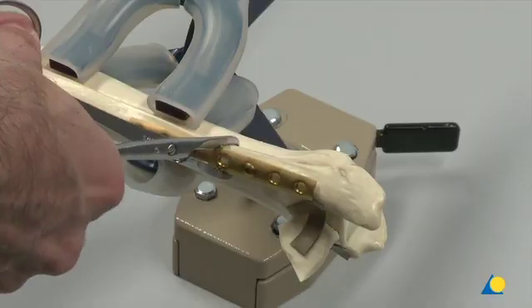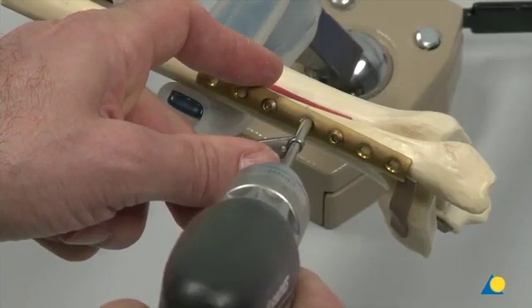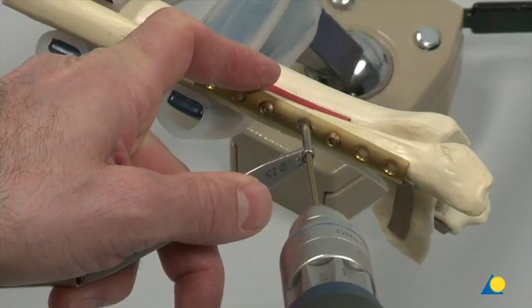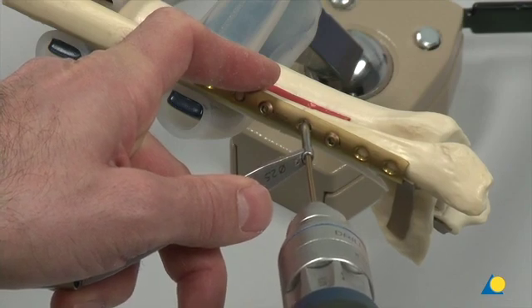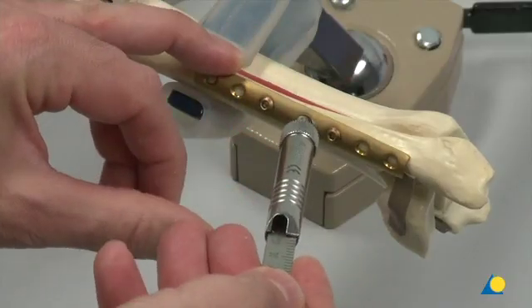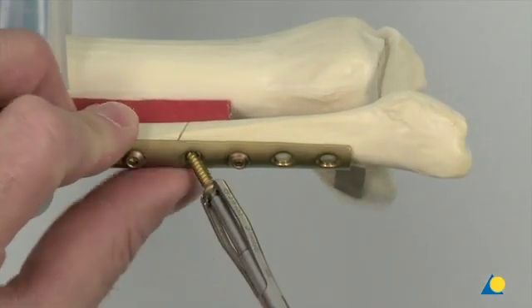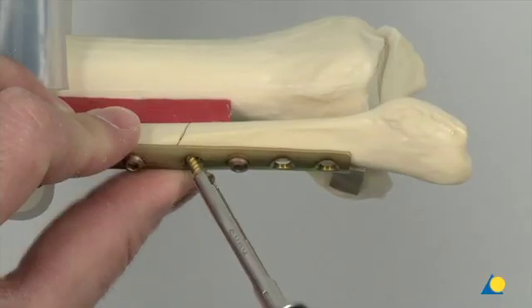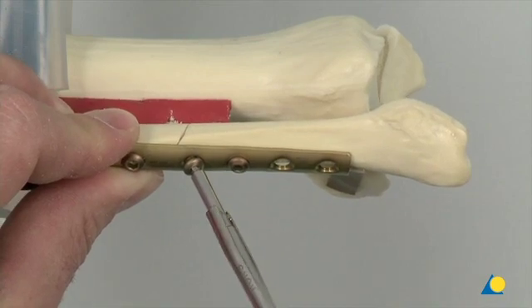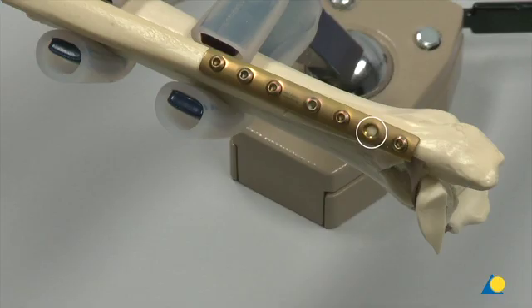The toothed reduction forceps is removed. The glide hole is drilled for lag screw insertion using the 3.5 mm drill bit and drill guide through the near cortex only. A thread hole is drilled through the opposite cortex using the 2.5 mm drill bit and drill guide. The required length of screw is measured using the depth gauge, and the 3.5 mm self-tapping screw is inserted, functioning as a lag screw. All the remaining plate holes are filled, except for the second distal hole, which will be used later for the position screw.